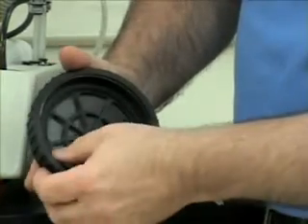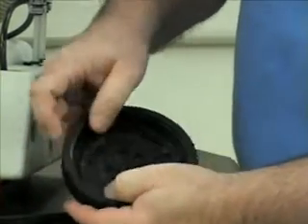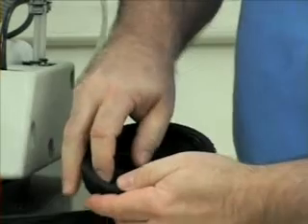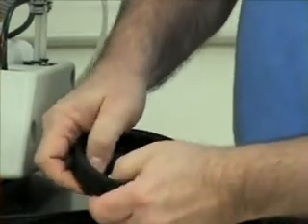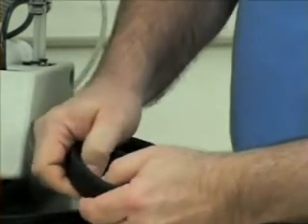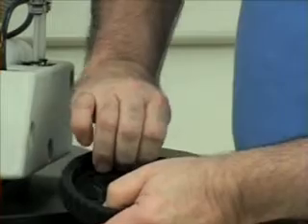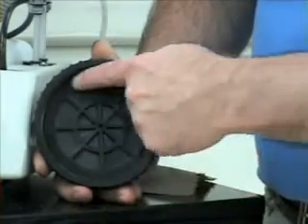I'm going to lay it back in, and then I'm going to begin to massage the ring, the square O-ring, into the groove with my thumbs, and it will run and hide from you a little bit. Sometimes you have to come from opposing directions. Okay, we've got the O-ring back in the groove.